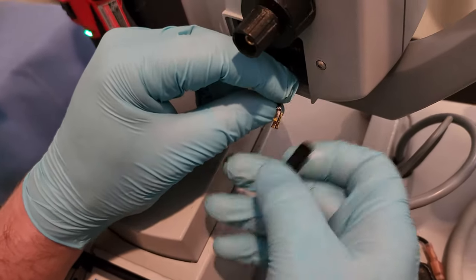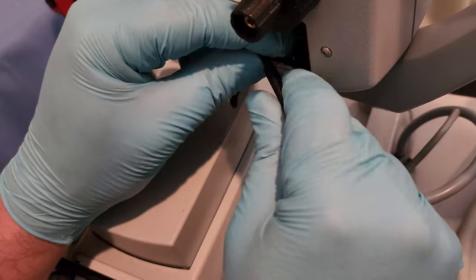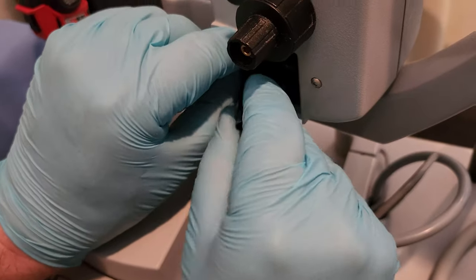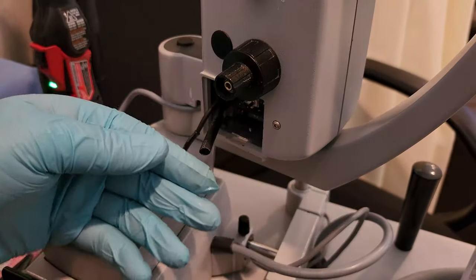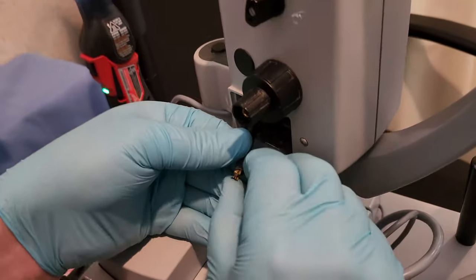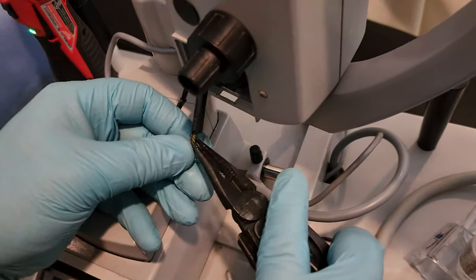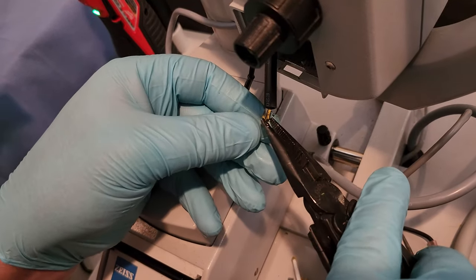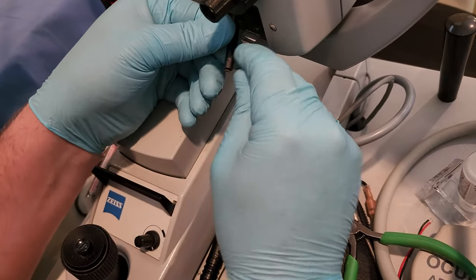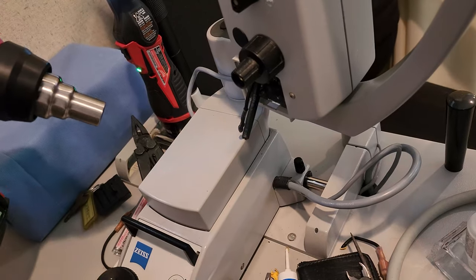And this guy will go up the connector. Come on, nice and easy. Nice and easy. There it is. Let's pull it through from this side. All right. So what I want to do is I want to make sure that this guy here, correct this just a little bit. Okay. Make sure this guy here comes down the port as far as possible. And then we'll use this guy.